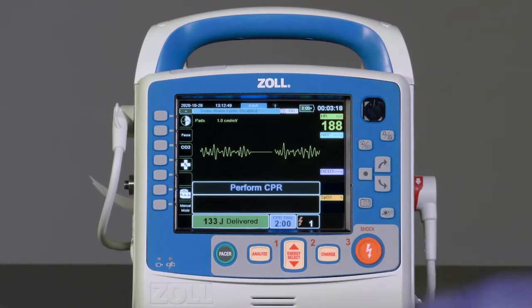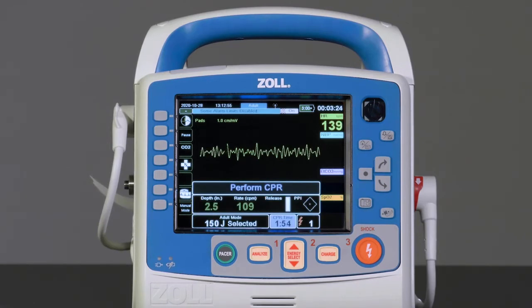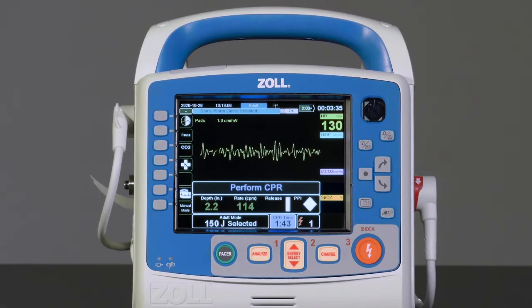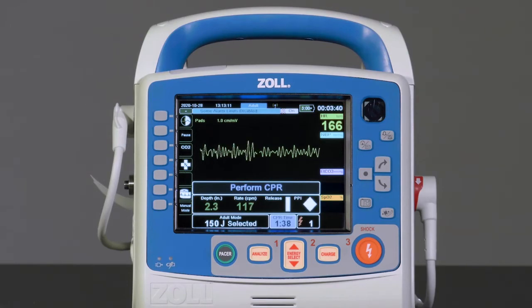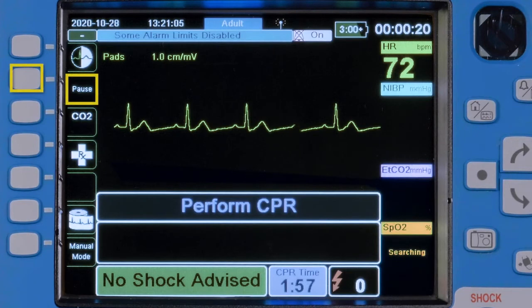Press the Shock button to deliver the shock to the patient. After the shock is delivered, a message and audible prompt to perform CPR appears. If Zoll CPR electrodes are being used, Real CPR Help is enabled. The X-Series Advanced will continue to prompt 2-minute cycles of CPR, followed by analysis and a shock or No Shock message.